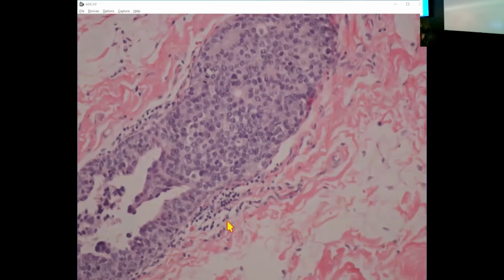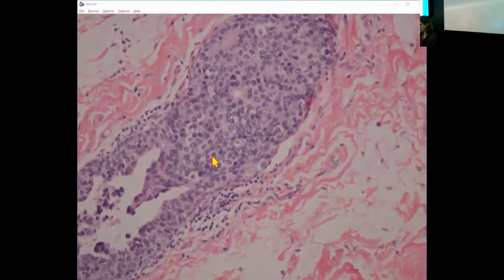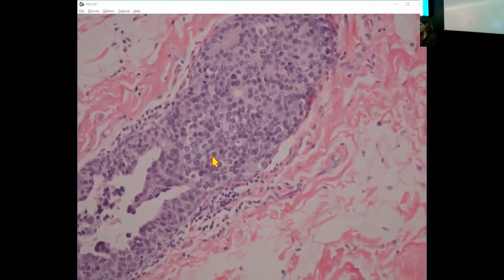You've got an epithelial proliferation. Maybe some of you think this is an obvious example of DCIS, and I think it is DCIS, but I don't think it's necessarily an obvious example of DCIS. There's some variability in the nuclei, and it's not massively involving the tissue. So if something limited, I might think about usual ductal hyperplasia in that setting.